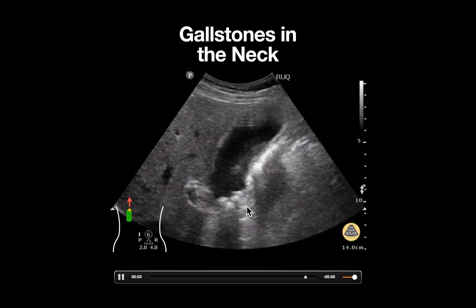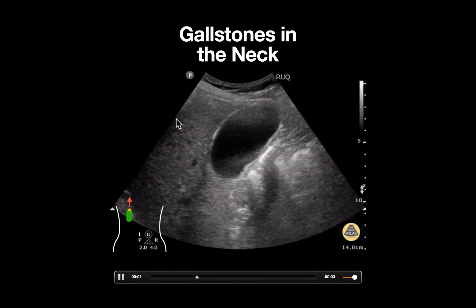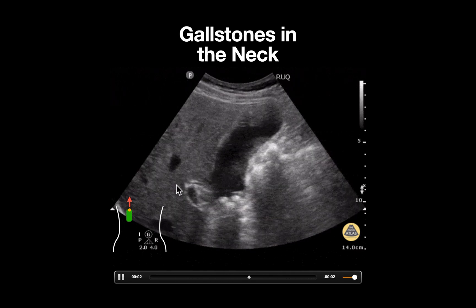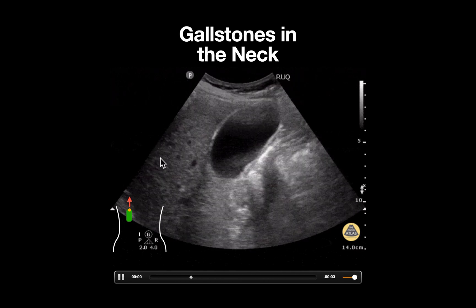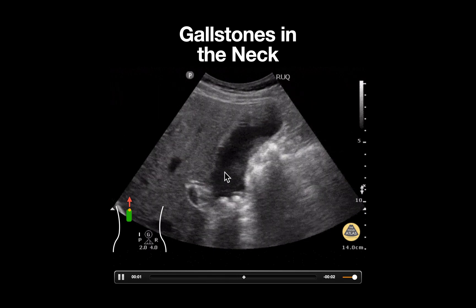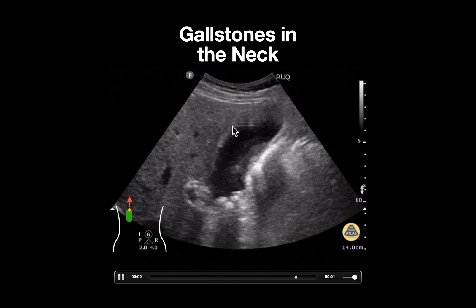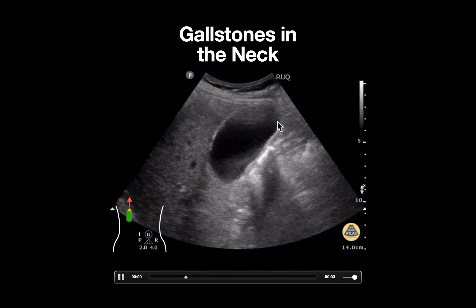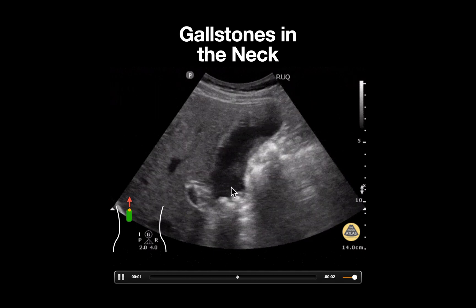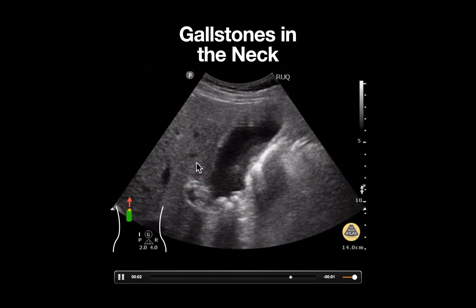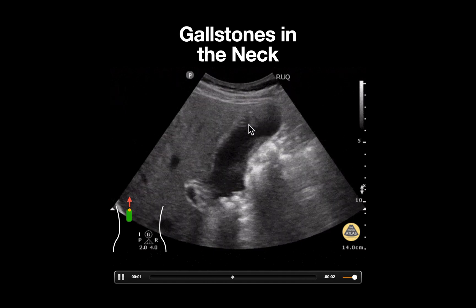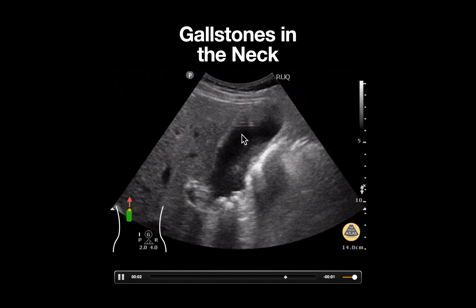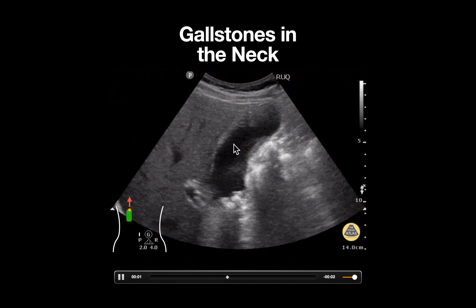In this image, we can appreciate the liver seen here on the left side of the screen. A long axis view of a distended gallbladder is seen here. Notice that the fundus of the gallbladder appears anechoic and normal.